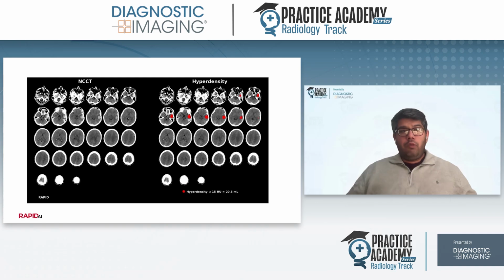So in this instance, the volume is 20.5 milliliters, and that's extremely helpful, and it's going to increasingly become more helpful in clinical practice, as we have recently concluded the ENRICH trial, which has shown that minimally invasive intervention in the setting of hematomas can drastically improve patient outcomes and length of stays. So now we routinely get asked by our neurosurgery colleagues to help calculate the volume of these hematomas to see whether or not the patient is a good candidate for intervention.